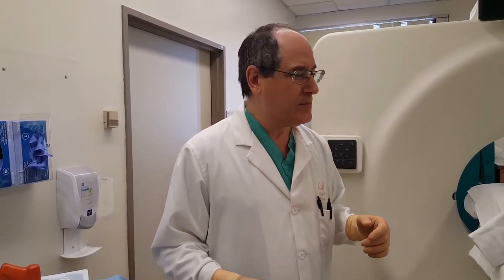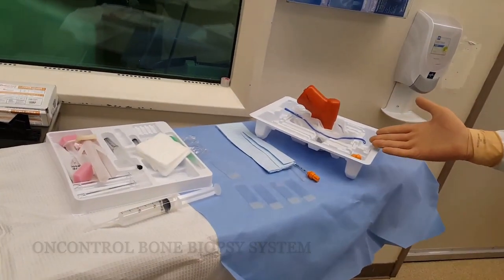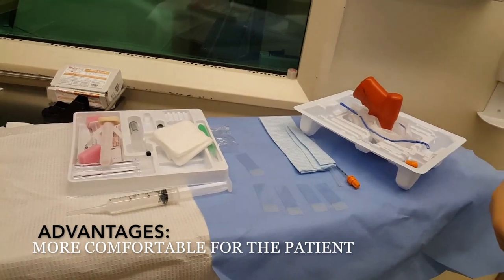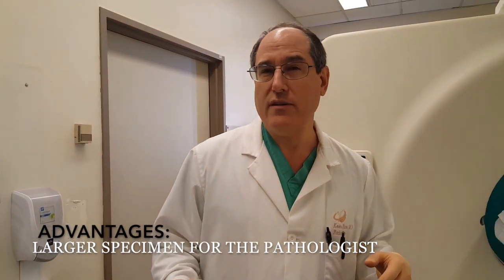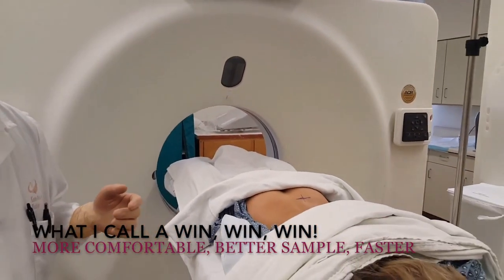Hey, I'm Dr. Kevin Rice, Radiologist at Valley Presbyterian Hospital. Today we're going to be doing a bone marrow biopsy for a patient with pancytopenia. We're going to be using the OnControl Bone Marrow Biopsy System, which uses a power handle. It's actually more comfortable for the patient. We get a larger specimen for the pathologist, and it's much faster. So it's much better for the pathologist, better for the patient, and better for the radiologist.